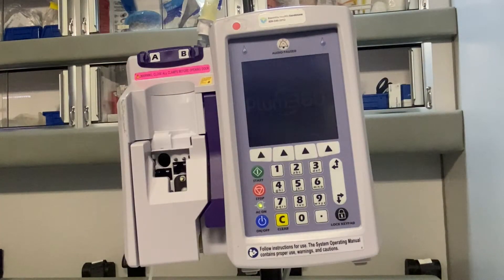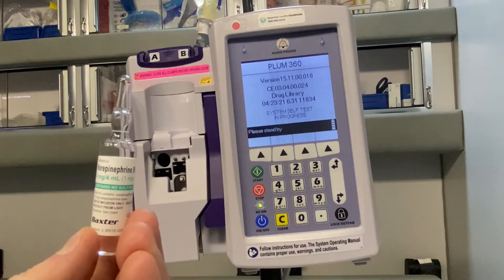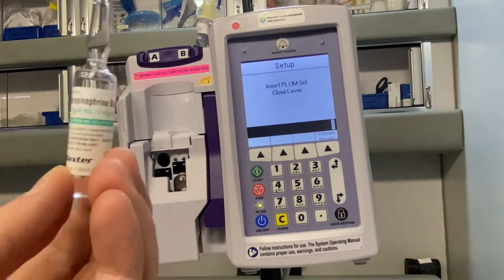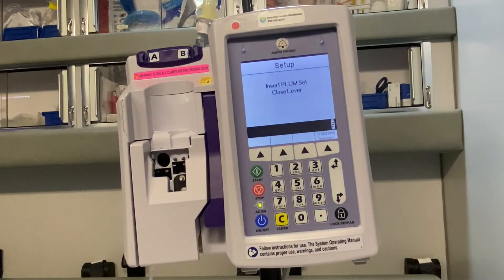For the sake of our scenario, we're going to say that we're going to give levophed, which is also known as norepinephrine. It comes in a 4 milligram and 4 cc vial — or ampule, actually. Our protocol is to draw that entire 4 cc's up, inject it into the 250 cc bag, and agitate and shake it up.